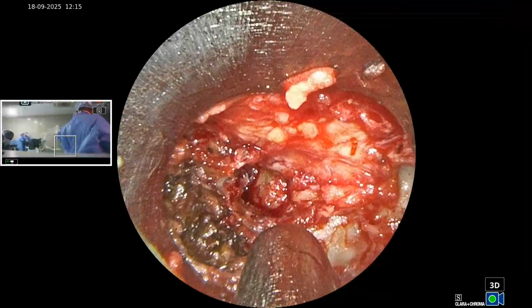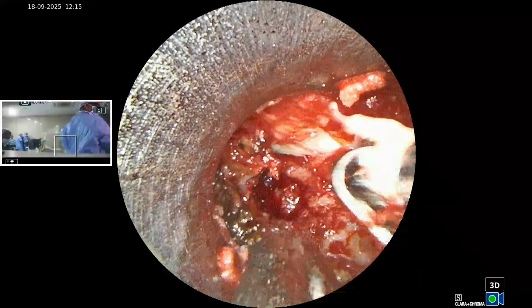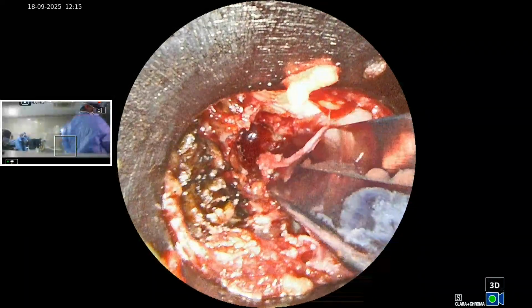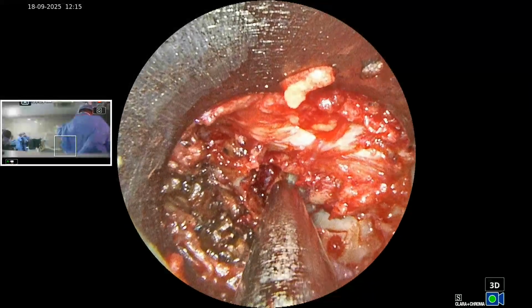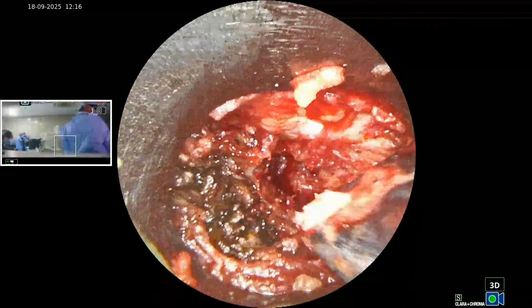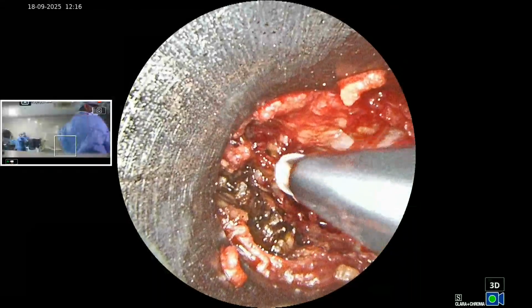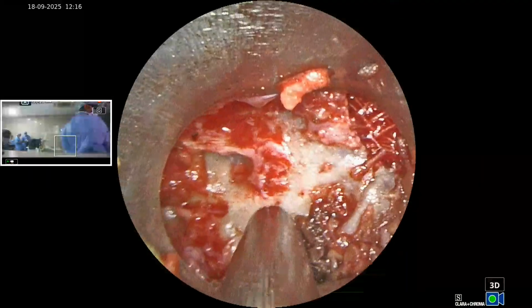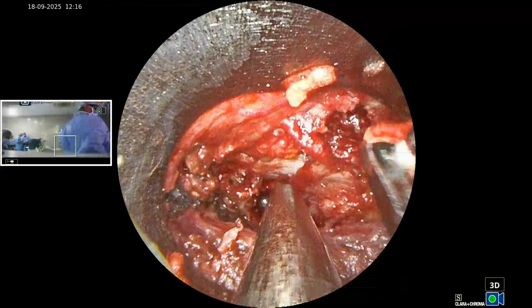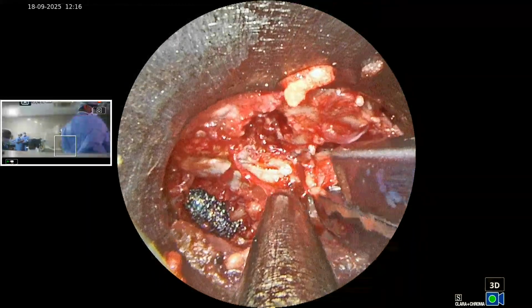She is having the osteoporotic and also scoliosis, homebound for years together, almost 7 years, severe claudication, and we have decompressed the one level now, that is the L4-L5, and this is the L3-L4 level. So this is the L3 lamina, L4 lamina, facet, spinous process, midline. Okay. Now we are at the left approach.